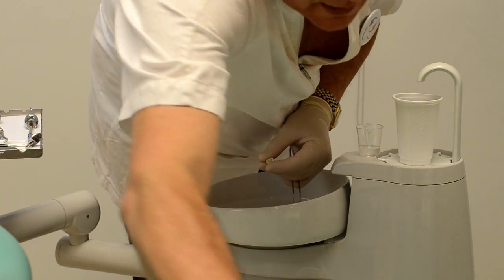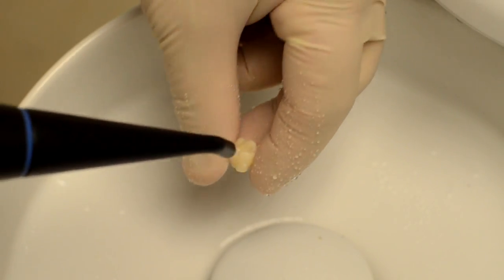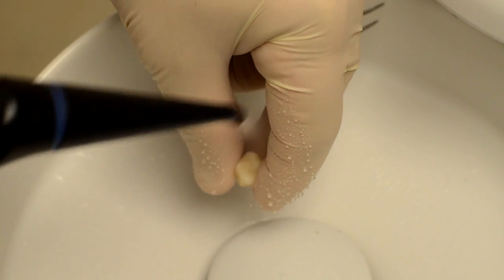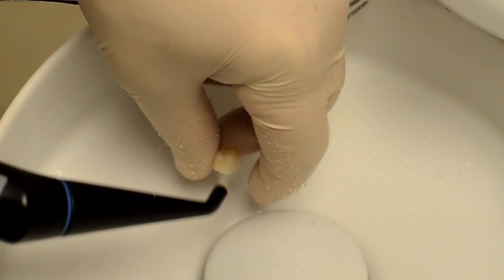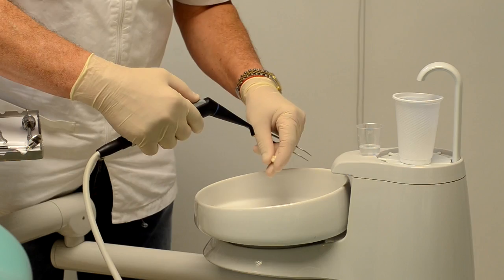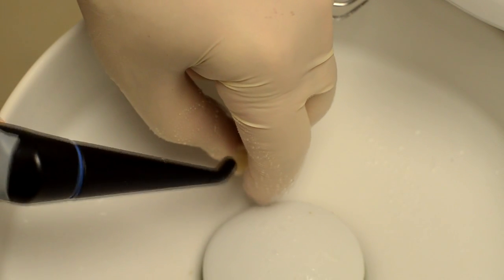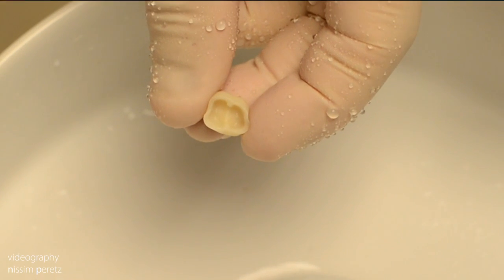Because of the Temp-Off, the crown is slippery, so you are advised to rinse its anatomical side first. Then turn the crown to the cement side and spray it approximately five seconds until all the cement is flushed away. Be advised to spray inside of the crown facing outwards so the splashes won't reach your eyes. The demonstration is over.